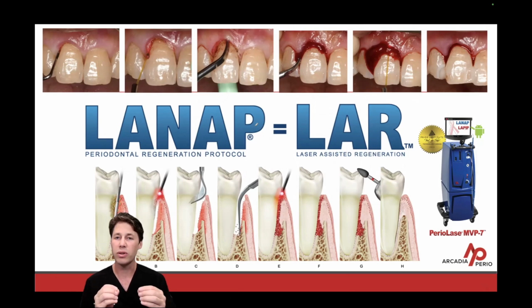We're going to remove all those non-working interferences, any wear facets, right? It's not occlusal equilibration, it's more like occlusal triage, right? We're eradicating those areas of potential interferences. Then we let everything heal, right? We're going to let things heal for 6 months to 12 months before we go back in and reprobe this patient.